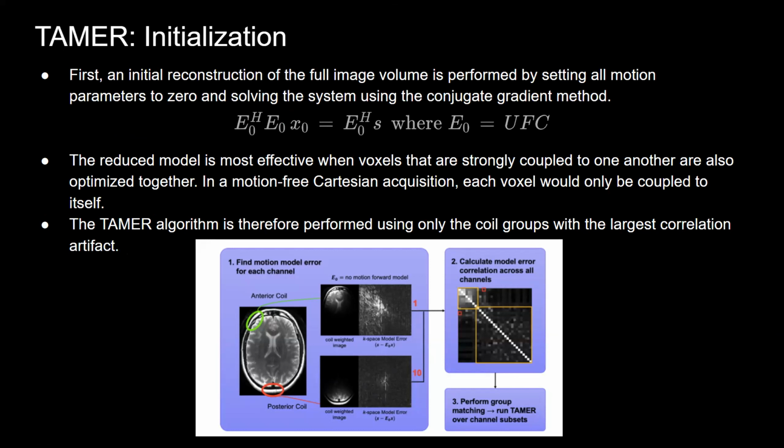This is the part where we basically get our fixed voxel values. What I really mean by that is they're going to choose a bunch of target voxel values, and these are the ones that we're actually going to change through each iteration. Whereas the fixed voxel values just stay the same. They will update occasionally, but for the most part, stay the same. So this is actually what makes the model a lot faster. We only have to deal with a small amount changing, about 5% of the total voxels.